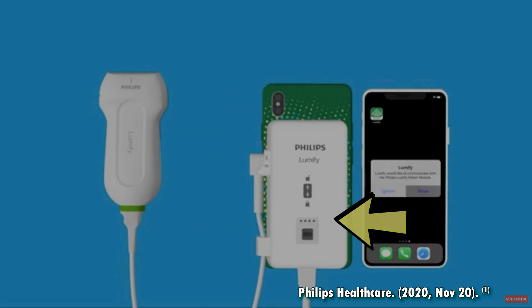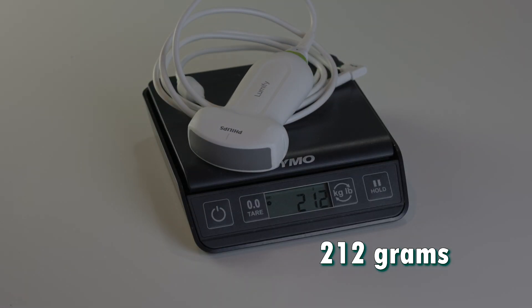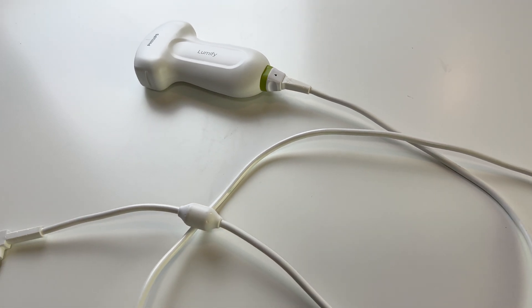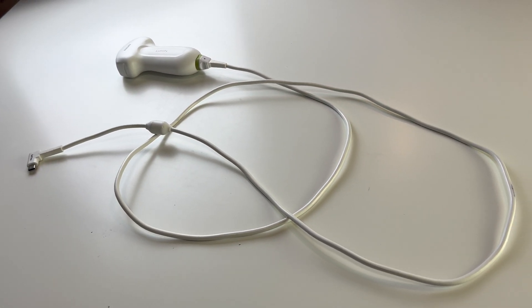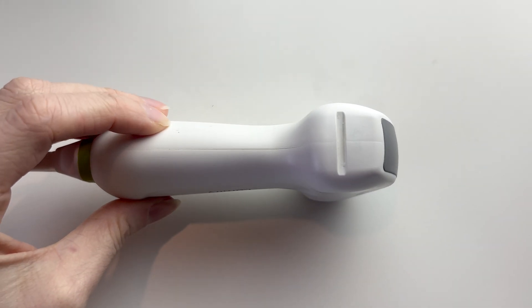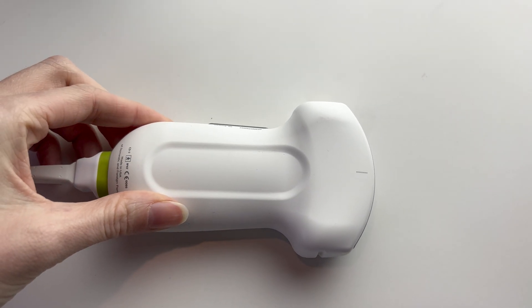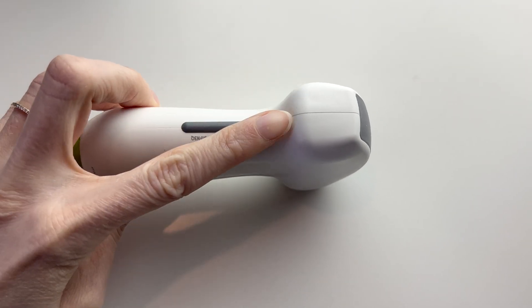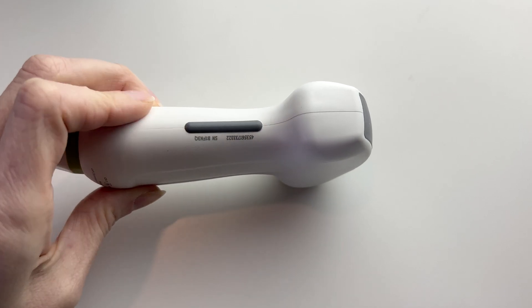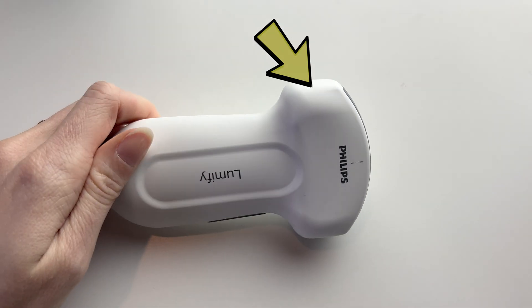The probe itself is quite light, weighing approximately 212 grams. It is a wired ultrasound with a nice long cable — one of the longest I've seen on a handheld. The body is a lightweight plastic with a very mild texture that makes it easier to grip. I never figured out what the little grey bar is, but maybe someone on Twitter can tell me. It is very easy to clean, and the only place where dirt would gather would be in the little side notch.